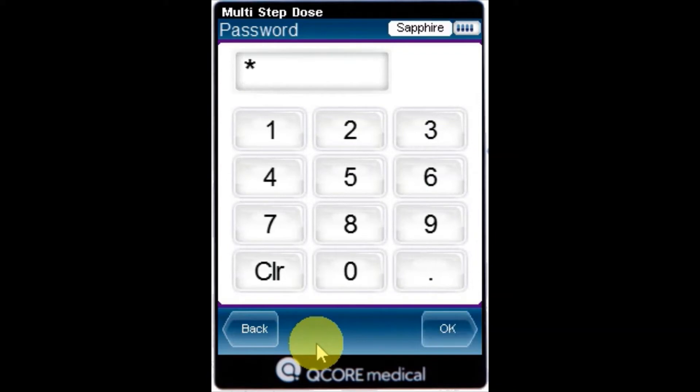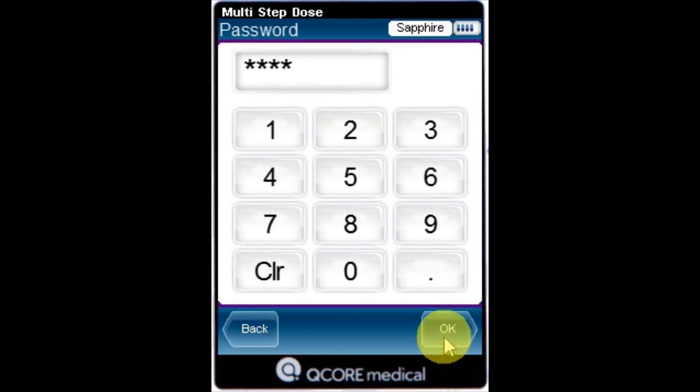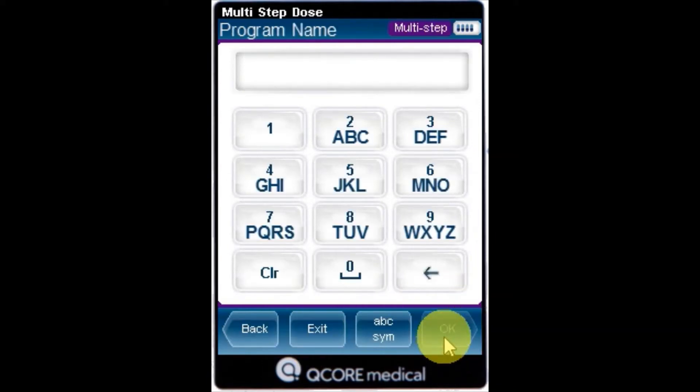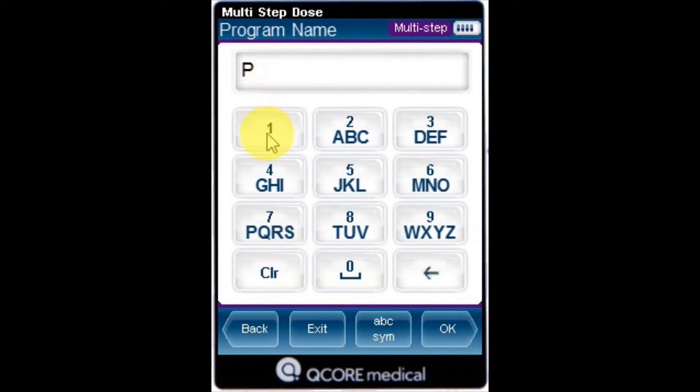Using the keypad, enter the appropriate password and then press OK. Using the keypad, enter a relevant name for the new program.